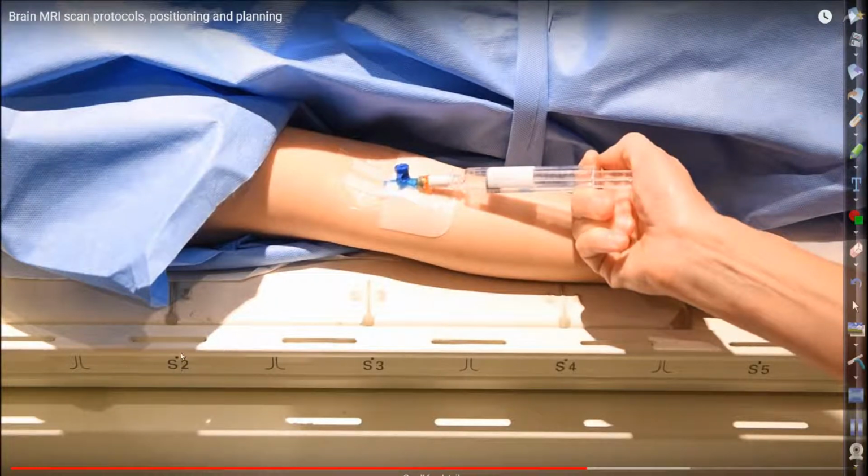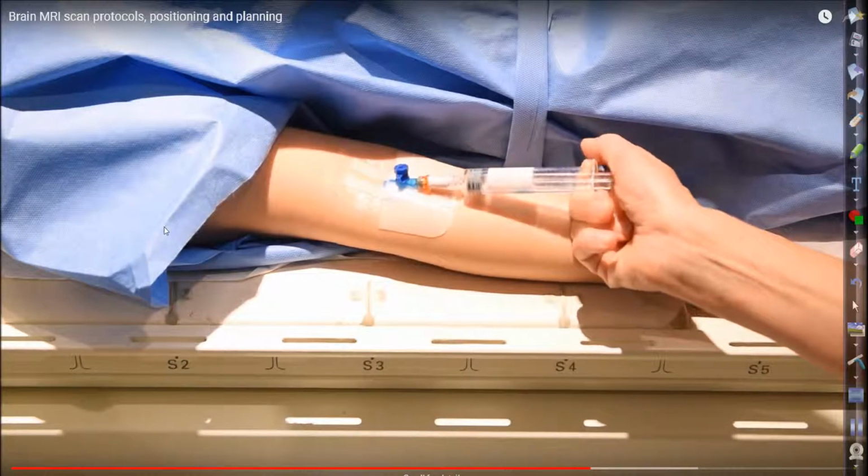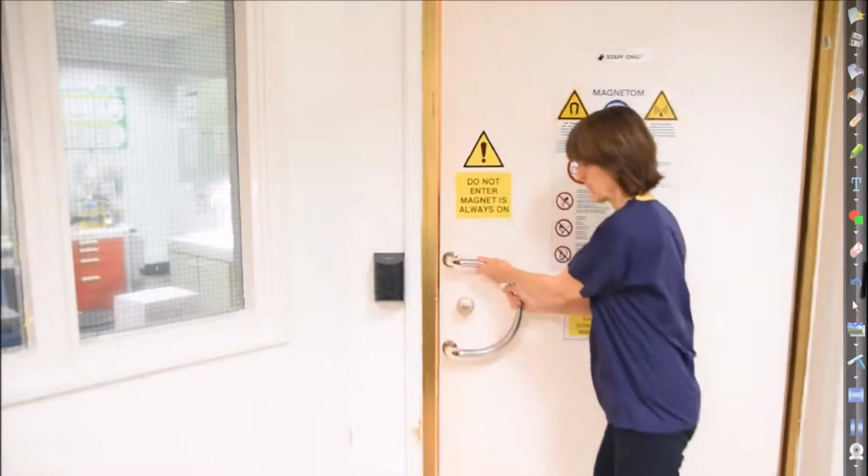These are the coils within the table. Remember those phased array coils that I talked about last unit in instrumentation, where you have coils as you go down the patient's spine? These are basically showing where those coils sit, so you can excite the different coils and turn them on or off. Make sure the patient is comfortable, and that the patient is feeling well before you leave the room.